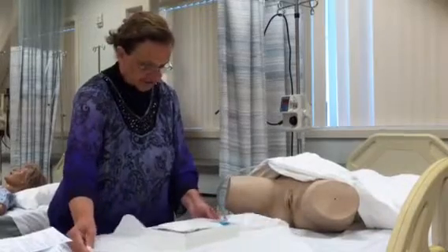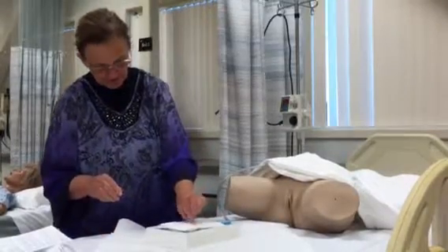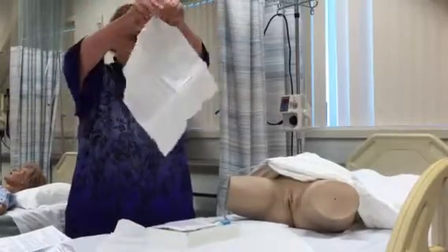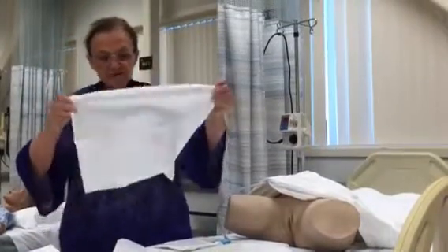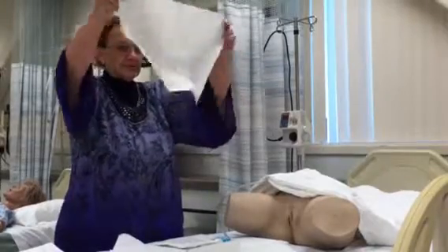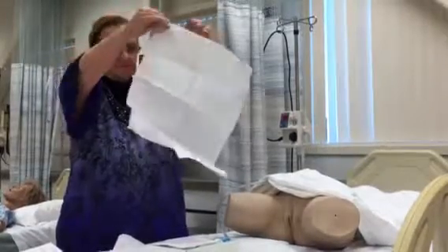Now, in general, everything will be given to you in the order in which you need to use it. Now, there happens to be a drape here. When I grab this drape for underneath, remember, edges are considered contaminated, correct? And I'm going to put the shiny side down, because if I get moisture going there, and I'm not going to mess with the middle at all, because that is going to be my sterile field.